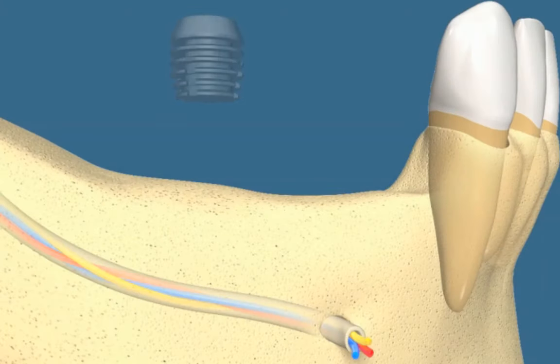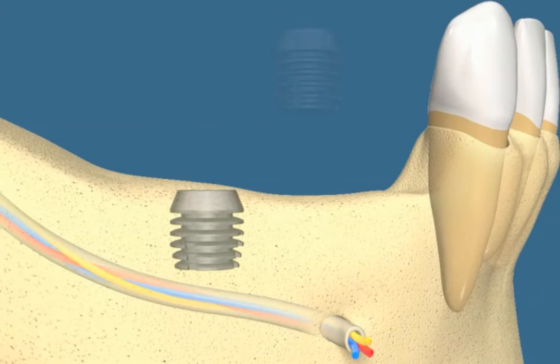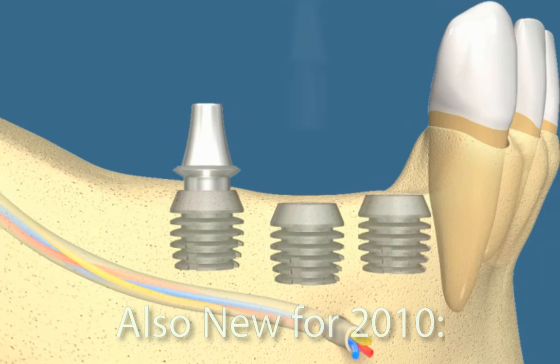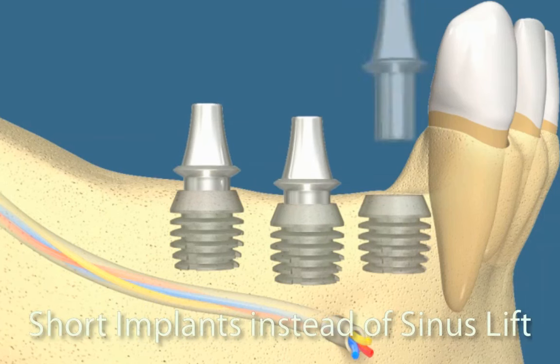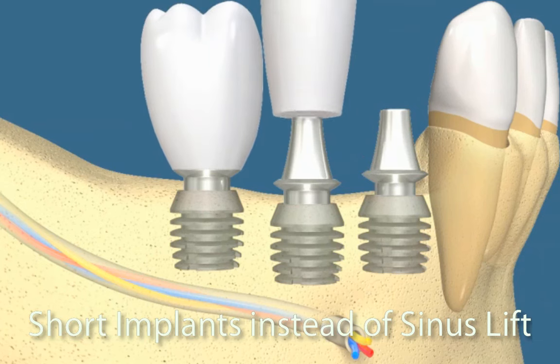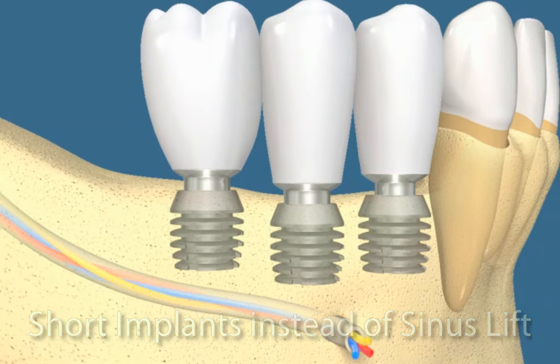This movie demonstrates the use of small implants made by Bicon, placed in the posterior mandible that has experienced severe atrophy. Their short length and width provide support while also avoiding the mandibular nerve. These 5 mm long implants can be placed in as little as 7 mm of bone and restored with posts and cores and crowns.